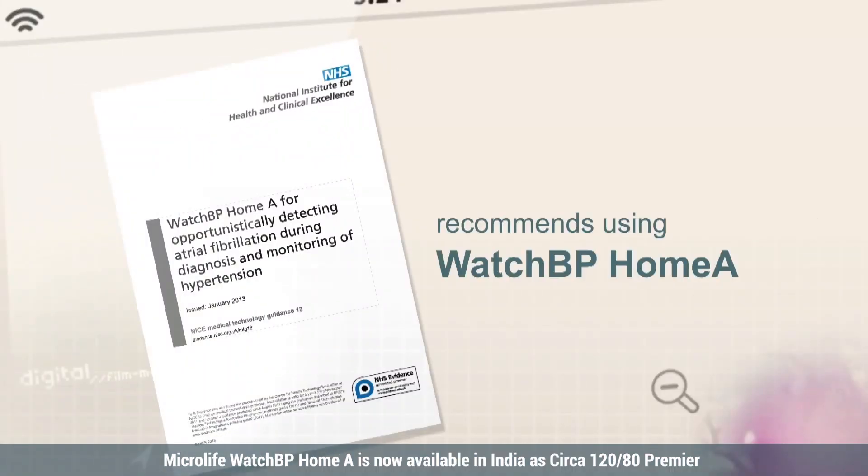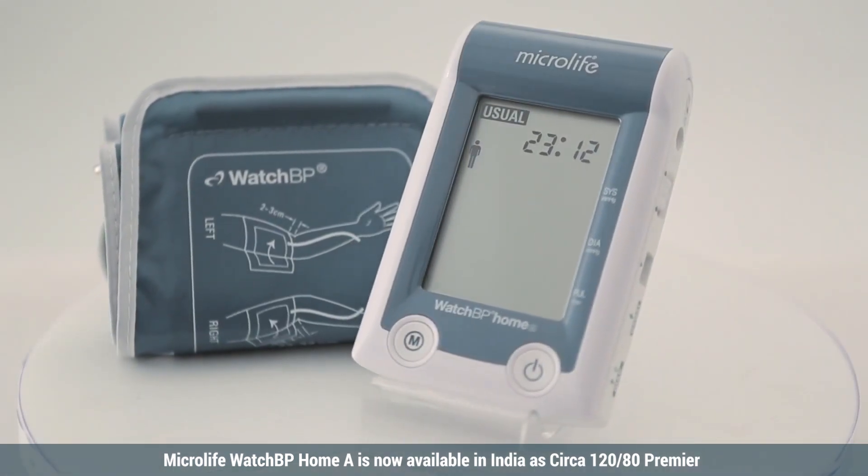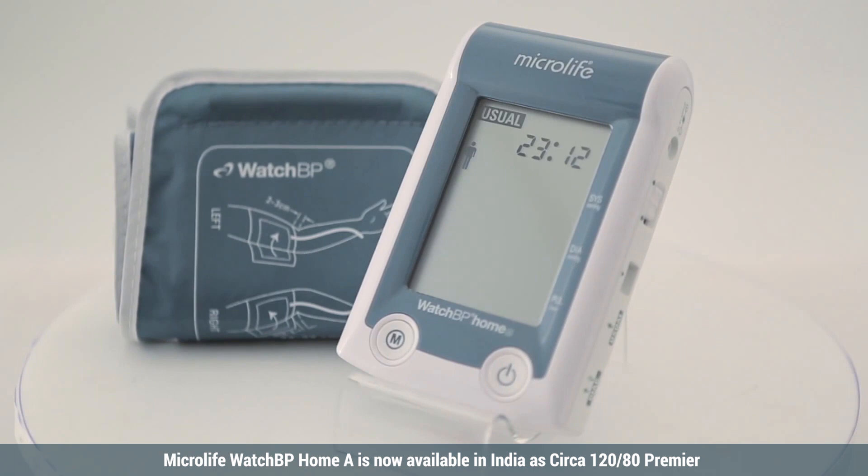The UK's National Institute for Health and Clinical Excellence recommends using the WatchBP Home A for hypertension monitoring for all clinicians in primary care. MicroLife WatchBP Home A screens for atrial fibrillation during blood pressure measurement.